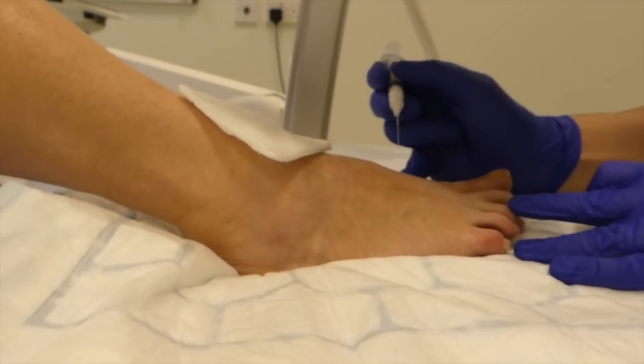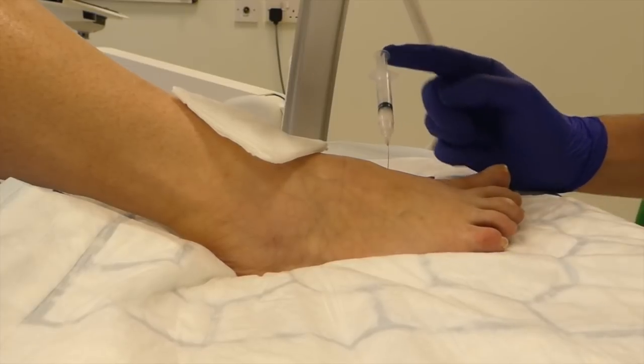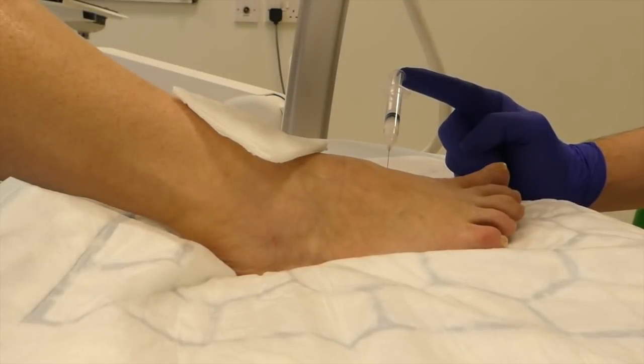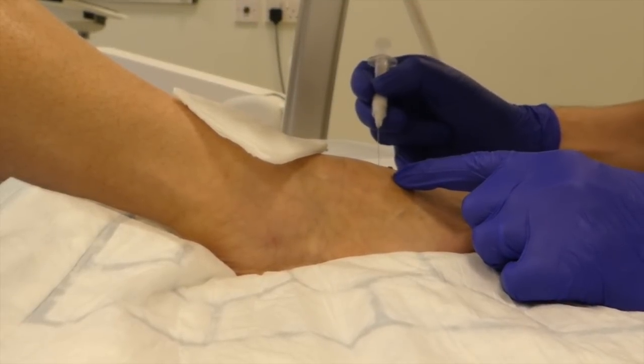Jilly, a little scratch — three, two, one. And we're going to check again. Okay, so again a little bit distal, so we'll come up a little bit. This is why we do these under guidance. Oh, that felt good.